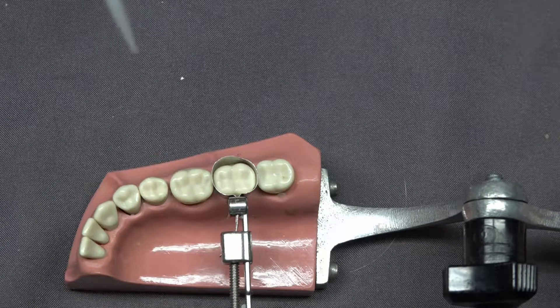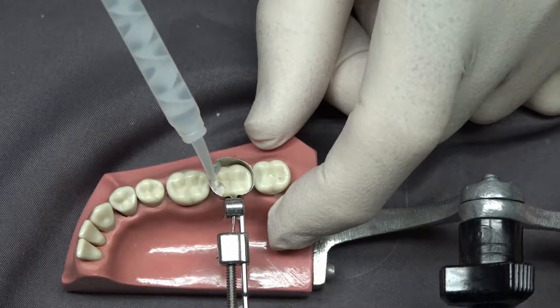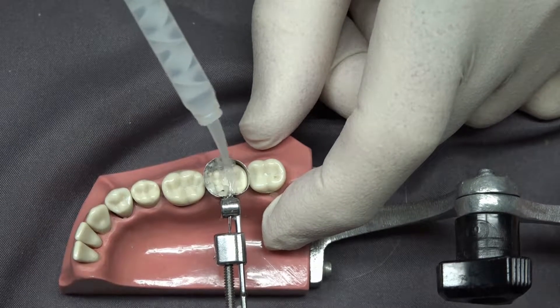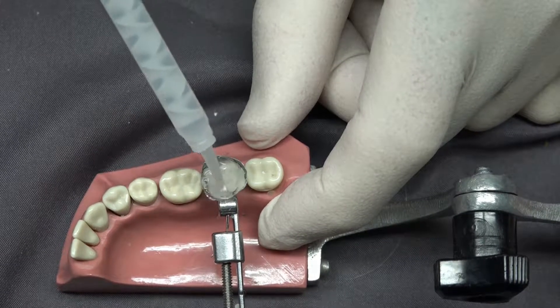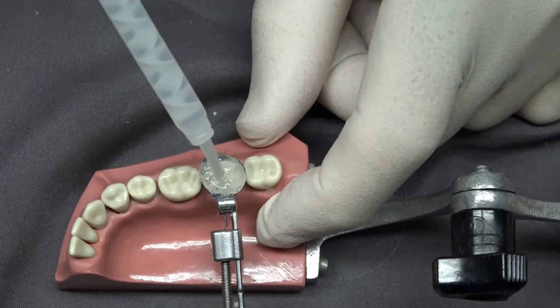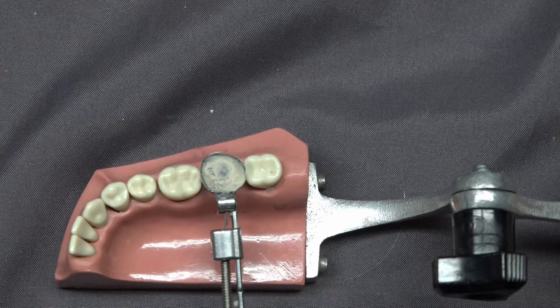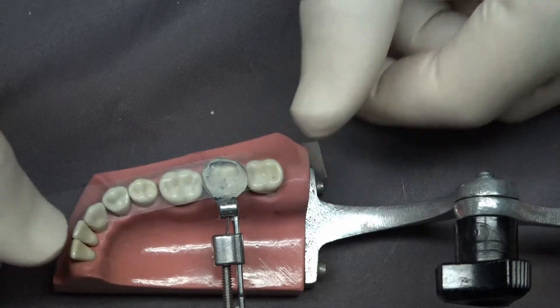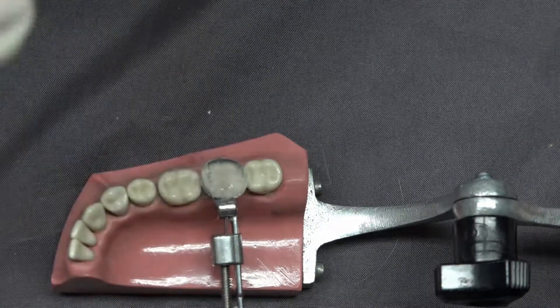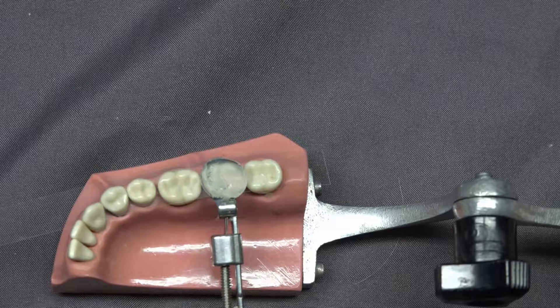Then we're going to inject inside this matrix band a clear polyvinyl siloxane bite registration material. This actually goes very quickly since it's a very small impression. After we're through getting all the surface detail on this tooth and the embrasures, we're going to take a Mylar strip and make a smooth surface. The Mylar strip is not meant to force the material into the tooth, but is meant to make a flat surface so that we can apply even pressure to this custom matrix later on when we're compressing the composite and curing it through this clear matrix.